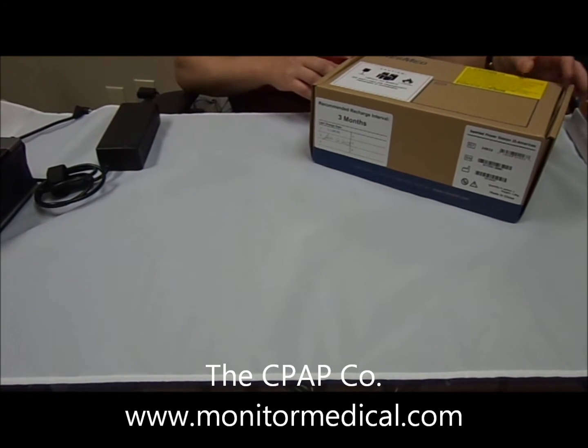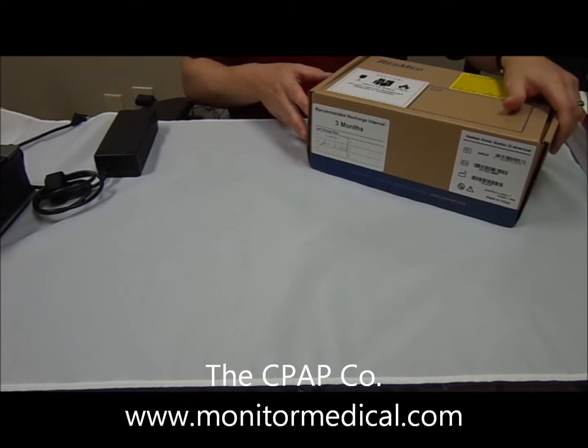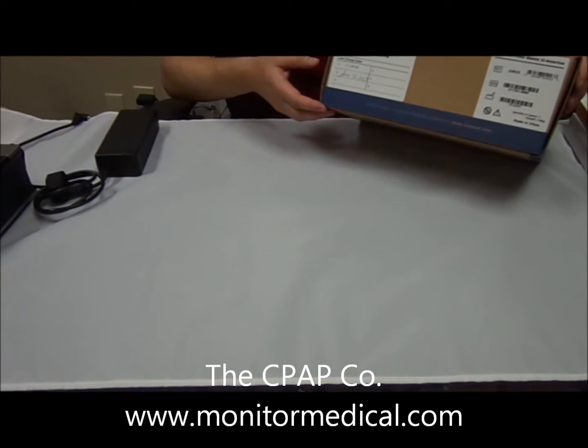Today we're going to be going over the ResMed Power Station 2 battery backup, and we're going to start with the box. This is the box for the ResMed Power Station 2.